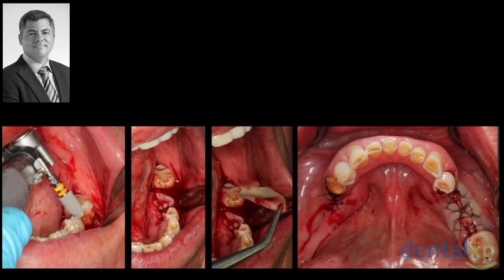Then, basically, you are doing your dentistry, everyday dentistry, everyday surgery. This device will give you the area where you have to drill and the angulations and depth, that's it. But it doesn't do surgery for you.